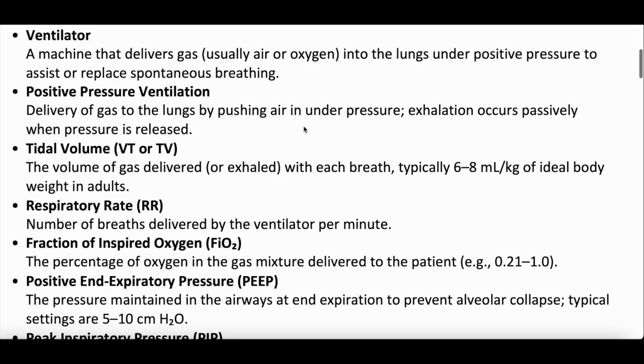In positive pressure ventilation modes, exhalation usually occurs passively. Okay, think about that. Exhalation occurs passively. So in all these modes, you provide an inspiratory pressure. Sometimes you set the inspiratory pressure, we'll talk more about that. Sometimes you set a tidal volume, but that volume, when it's being pushed into the lungs, generates a pressure. But all the exhalation that occurs happens passively.